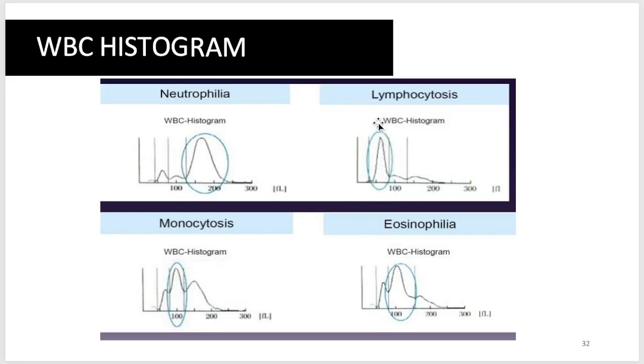Therefore, we all know that this is lymphocytosis. However, pag nasakit na ang problema, yung mid cells, we will not be able to identify kung ano ba talaga. Whether it is monocytosis, eosinophilia, or basophilia. But we all know that these three cells could be the reason for the increase of that particular parameter. I hope you understand that concept, no?